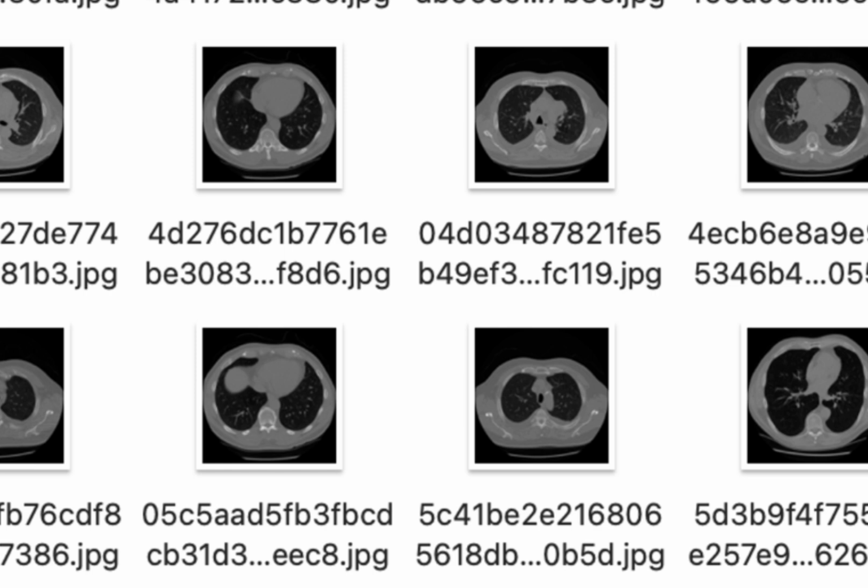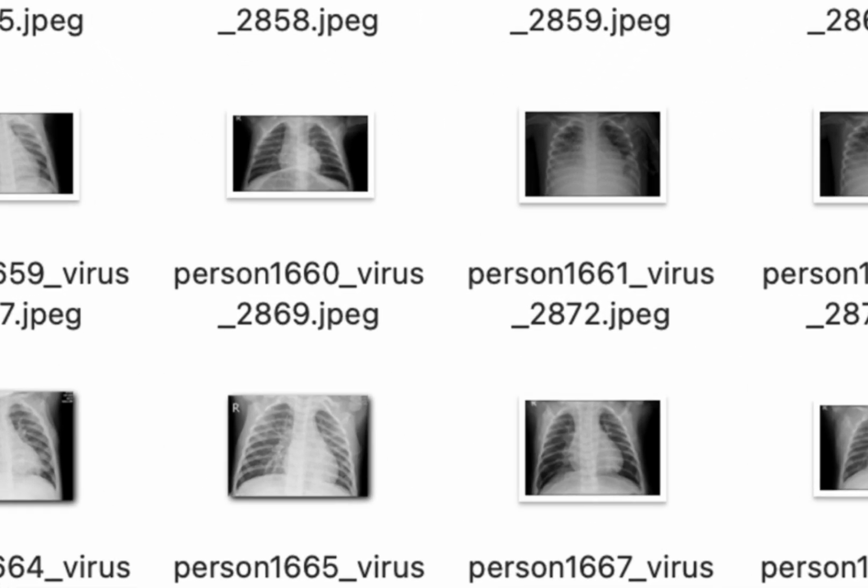The amount of data will make it more accurate, but there's another factor which also makes it more accurate, and that's the quality of the data. If we give the model a data set of poor quality data, it'll do a lot worse than if we gave it a high quality data set.